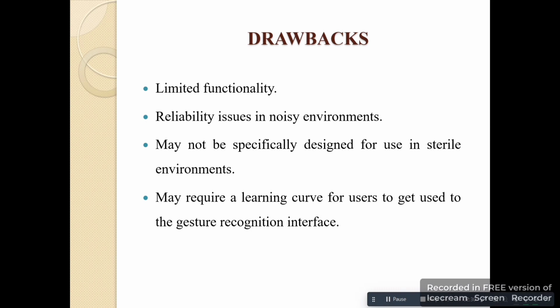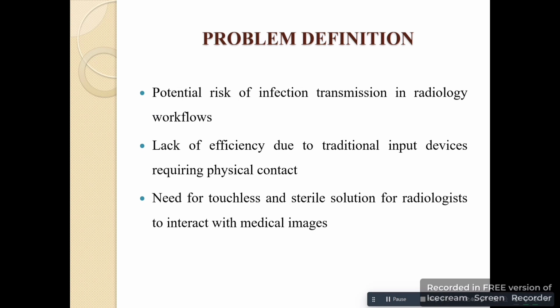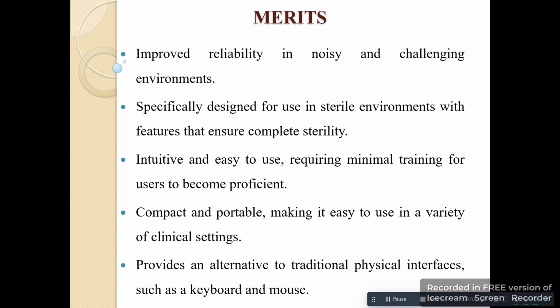Drawbacks: limited functionality, reliability issues in noisy environments, may not be specifically designed for use in sterile environments, may require a learning curve for users to get used to the gesture recognition interface. Problem definition: potential risk of infection transmission in radiology workflow, lack of efficiency due to traditional input devices requiring physical contact, need for a touchless and sterile solution for radiologists to interact with medical images.